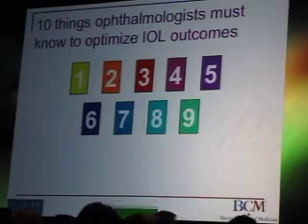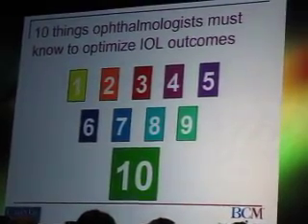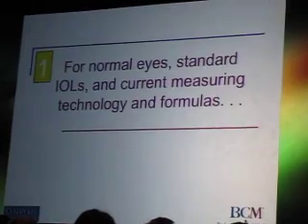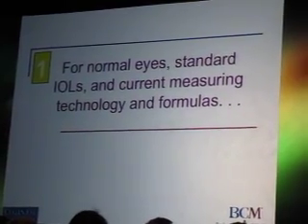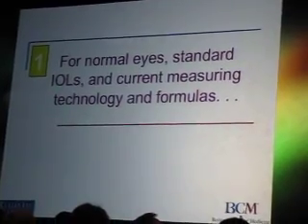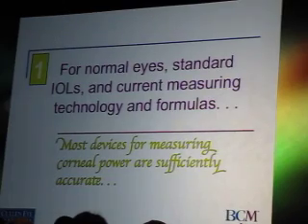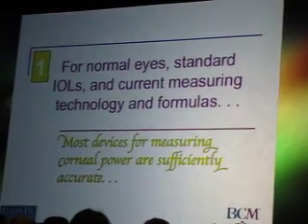So I want to share with you 10 things that I think ophthalmologists need to know about the cornea in order to maximize their IOL outcomes. Number one, for normal eyes, for standard IOLs and current measuring technology and formulas, most devices for measuring corneal power work quite well. They're satisfactory.